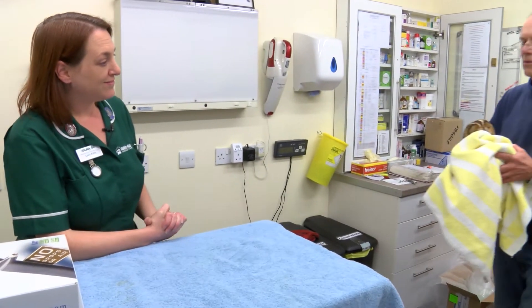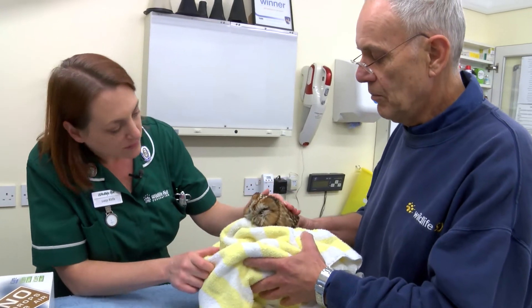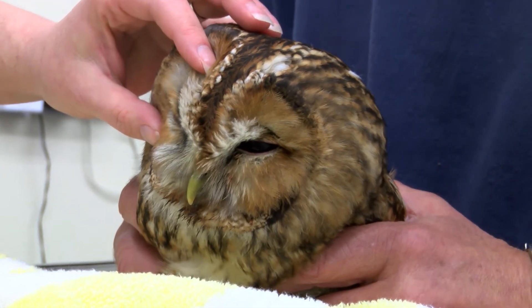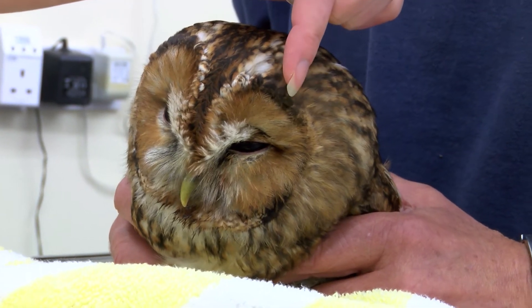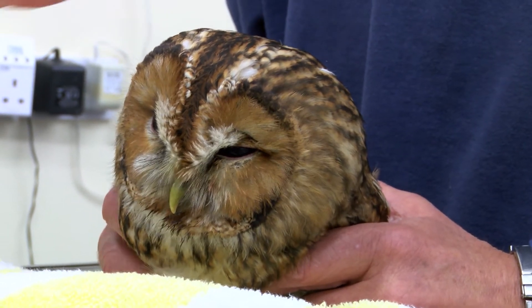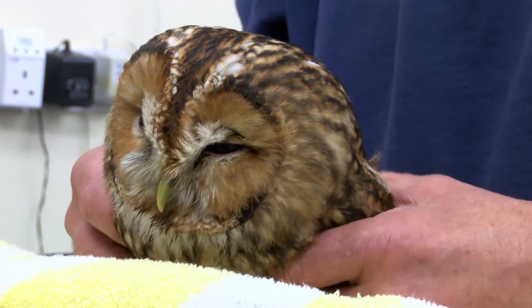I've got a very biting owl here that only came in this morning. I know you've looked at his eye very briefly to see what's going on, but we'll have a better look. So this is his good eye, and obviously this one is the painful eye. We know this eye has had a bleed into it, and that's why I want to make sure that the pressure's not too high and causing him more pain in that eye.